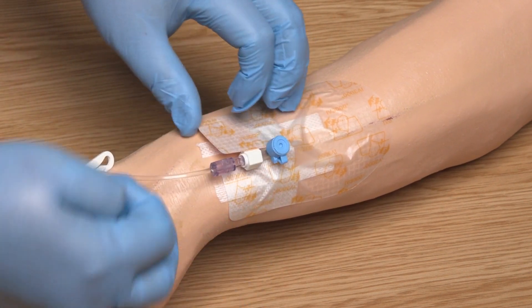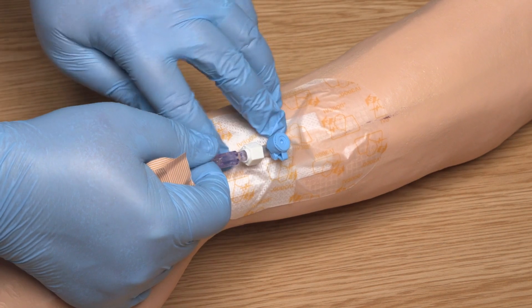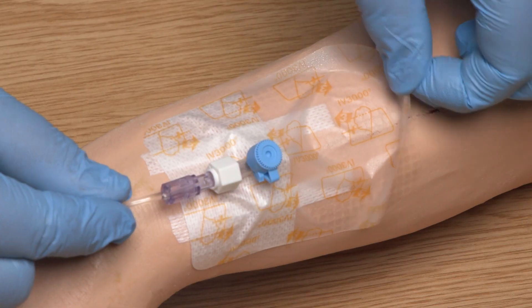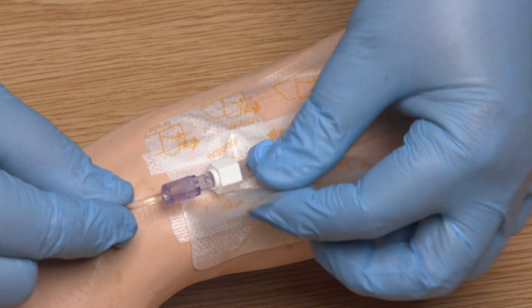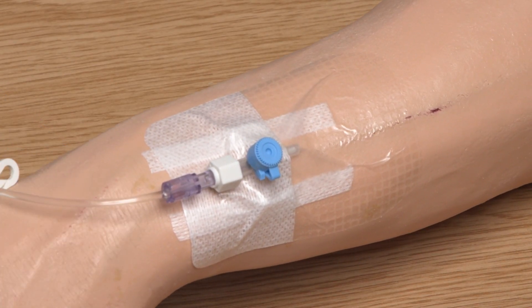Following completion of the procedure, I can dispose of used equipment into the clinical waste, remove my PPE and perform hand hygiene. Redressing of the vascular access device should be documented in the associated care plan.